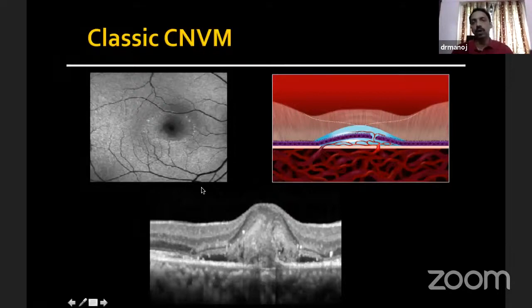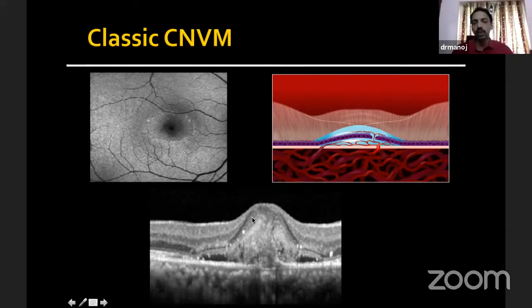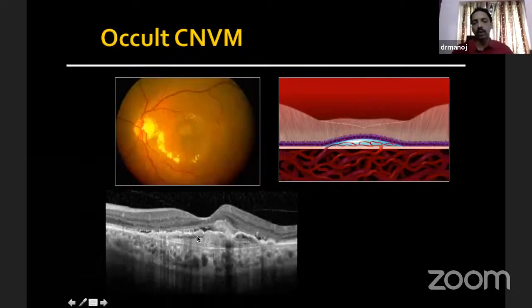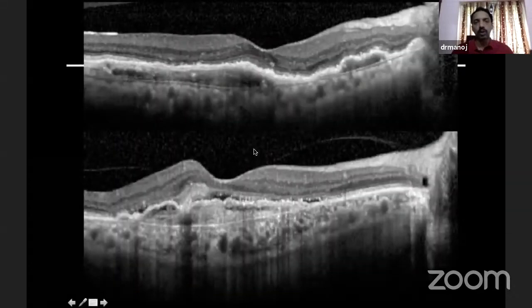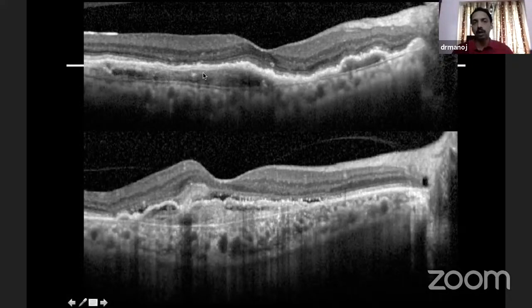OCT is very helpful in differentiating choroidal neovascularization. In classic CNVM (type 2), the lesion is above the retinal pigment epithelium — the RPE is fairly normal except for a small breach, but the lesion lies above it. In contrast, in type 1 choroidal neovascularization, the lesion lies under the retinal pigment epithelium — also called occult choroidal neovascularization. In this patient, the whole RPE is elevated and all the content is lying under it — this is a diffuse type 1 CNVM.